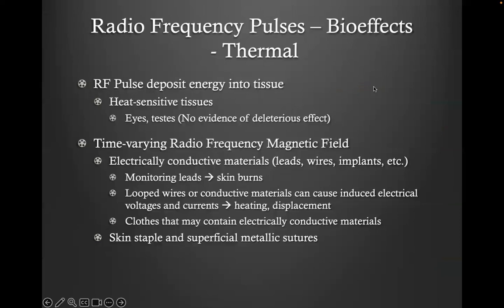So radio frequency pulses are mostly thermal effect. The RF pulses will deposit energy into the tissues. The larger the patient, the more energy is going to be there, because you are going to have more protons within this person to be excited. So there are some heat-sensitive tissues, for example, eyes and testes, and there's no evidence of deleterious effect, but you could have some sensation there.